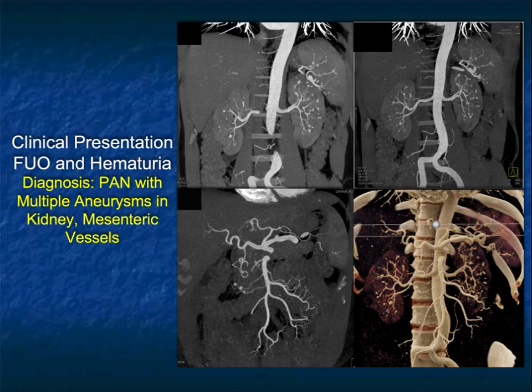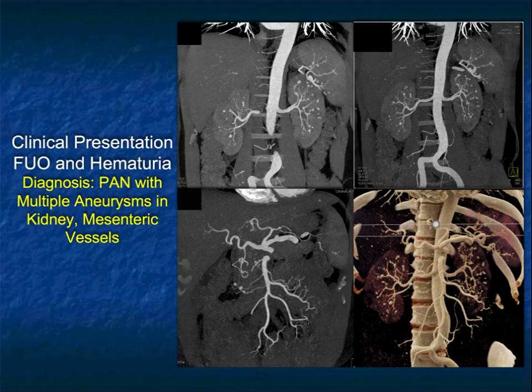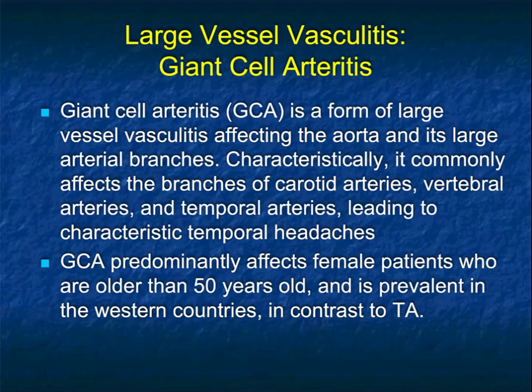Here's a good example making the point. Several MIP images and a cinematic rendering are shown for a case of polyarteritis nodosa, where the original interpretation did not suggest multiple small aneurysms — which are extremely obvious in the kidneys, the splenic artery, and the SMA and its branches — because they were little dots no one really understood. It was only when we did the 3D that we could make a very specific diagnosis.